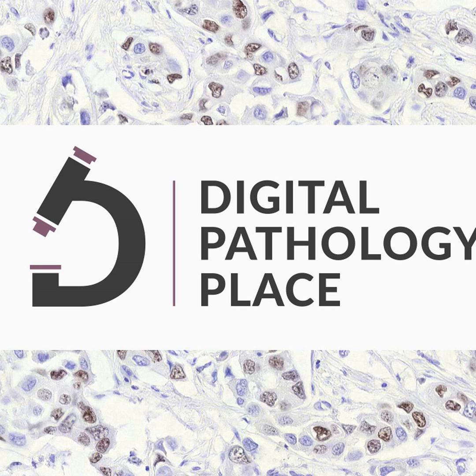But the current surveillance and diagnostic strategies rely on, so here we're talking radiology at the moment, contrast-enhanced CT and MRI, and they suffer from operator dependence, limited sensitivity, and interpretive variability. We know that every time a person looks at something and a different person looks at it, you have inter-observer variability, whether it's pathology images, radiology images, or whatever you're trying to assess.